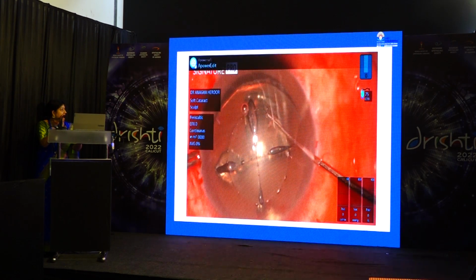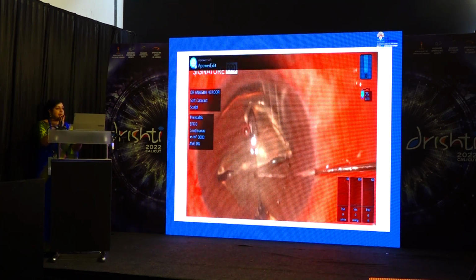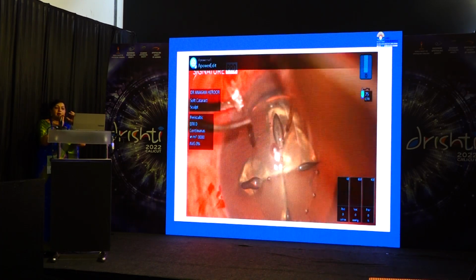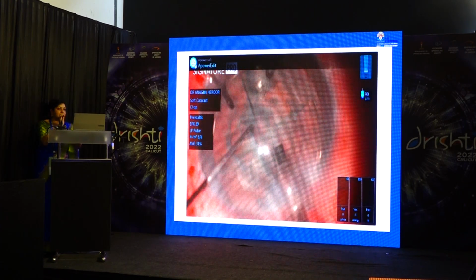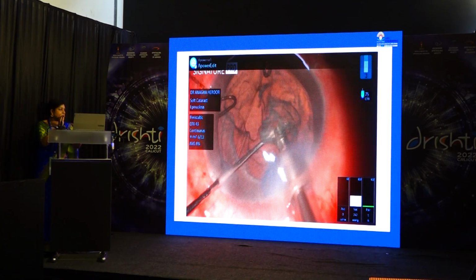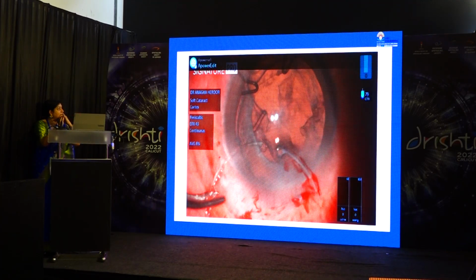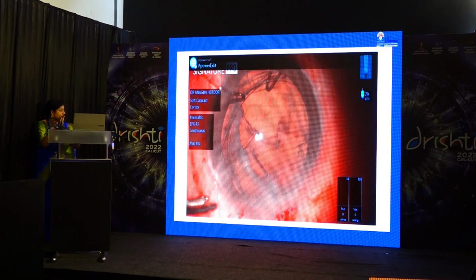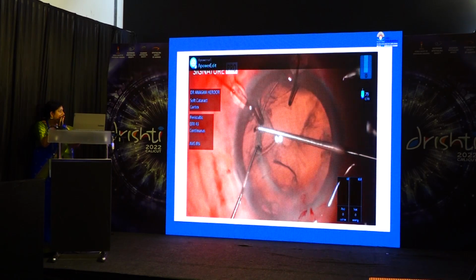Now, this was a patient of trauma with subluxated cataract, and the advantage of a femtosecond laser is you can actually center it on the scanned capsule, and as we know, in such cases, the capsulotomy is the most critical part because we are also planning to put a CTR. So we are first anchoring it with the capsular hooks, and now we are putting in a CTR so as to give a good vertical and horizontal support to the capsular bag.